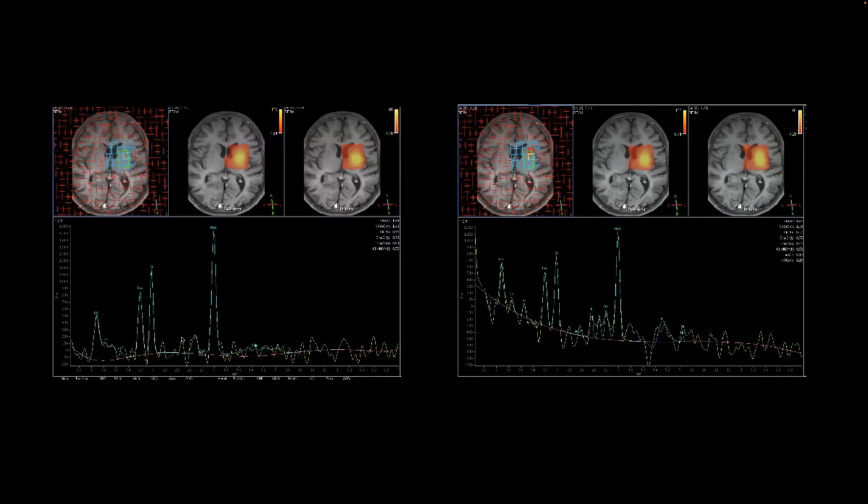I cannot appreciate any diagnostic peaks. There's a normal NAA peak, choline, creatine. The peaks, the ratios are normal. But I think the peaks are kept in the basal ganglia and not in the abnormal white matter.